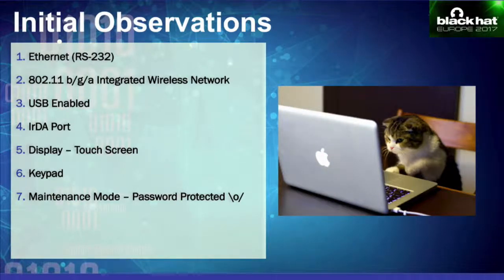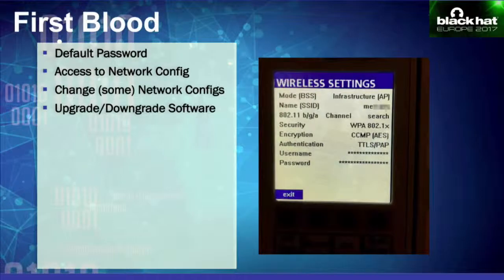required a password. So as soon as we saw that there is a maintenance mode, we started to Google if there is a default password which is out there. We tried to locate manuals, help forums, etc. And so we eventually found the default password, and obviously it worked because no one changes the password on these things. It's one of the most common issues.